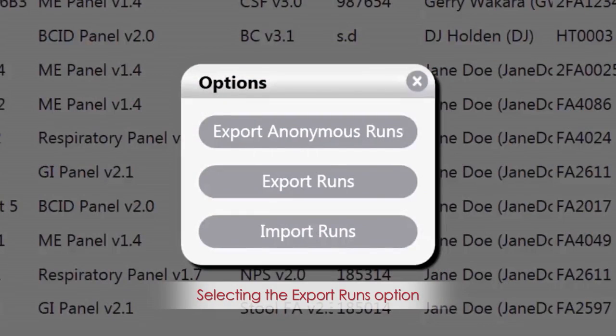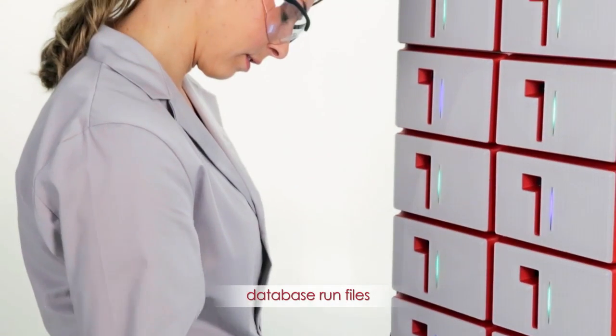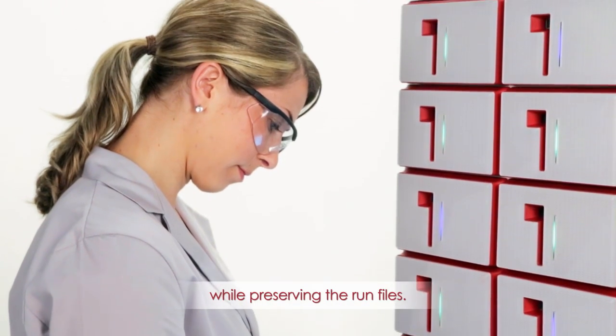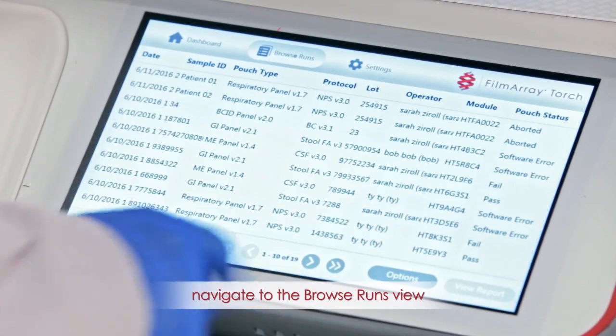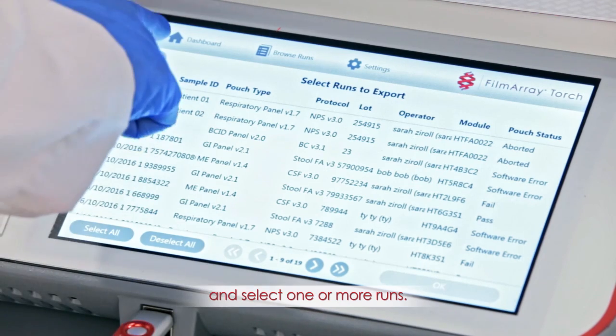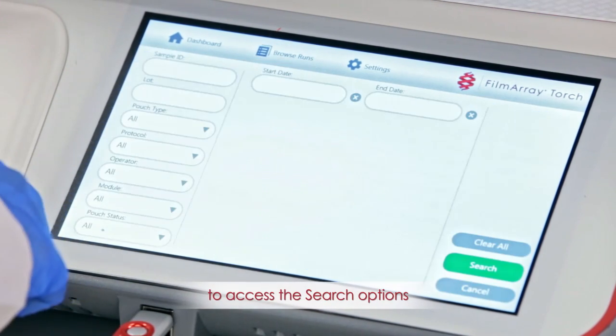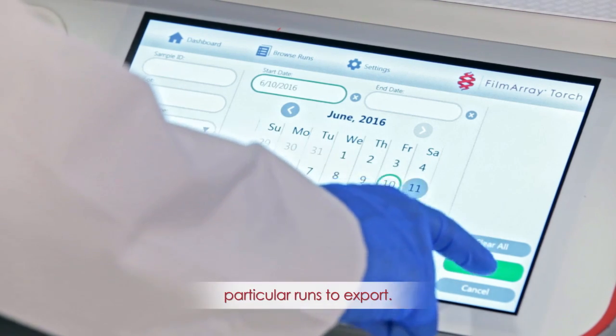Selecting the Export Runs option enables you to save a copy of one or more database run files while preserving the run files. To export runs to a file, navigate to the Browse Runs view and select one or more runs. Click the magnifying glass to access the Search options that enable you to locate one or more particular runs to export.